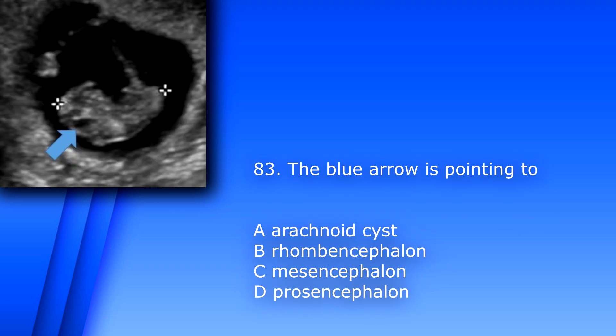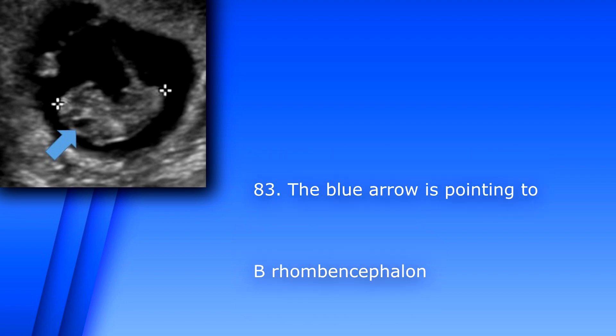Question 83. The blue arrow is pointing to? A. Arachnoid cyst. B. Rhombencephalon. C. Mesencephalon. D. Prosencephalon. The answer is B, rhombencephalon.